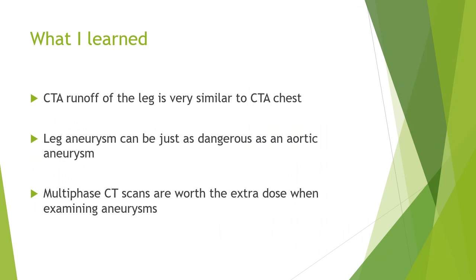Throughout this process, I learned that a CTA runoff has a very similar function to a CTA chest. The locations are different, obviously, but you're looking for similar pathologies. I also learned more about multi-phase CT exams and how looking at blood flow through different stages is very useful, particularly when looking at aneurysms.